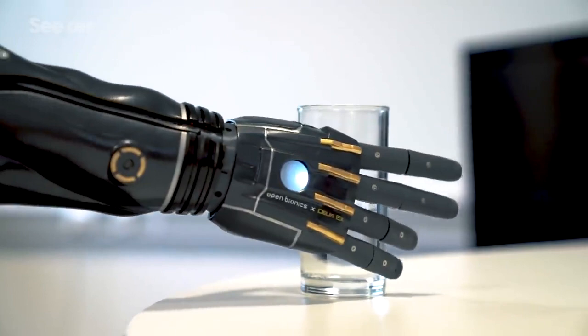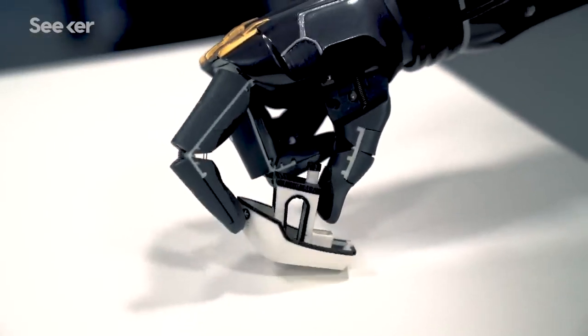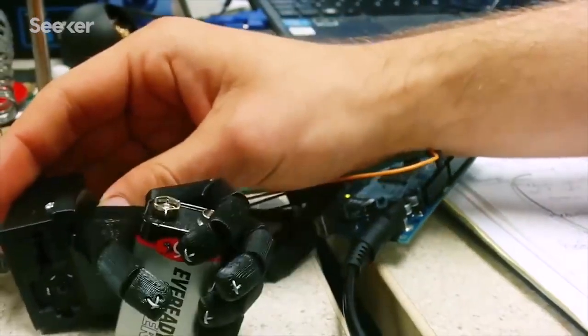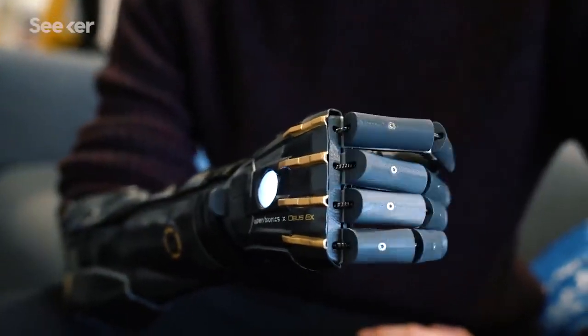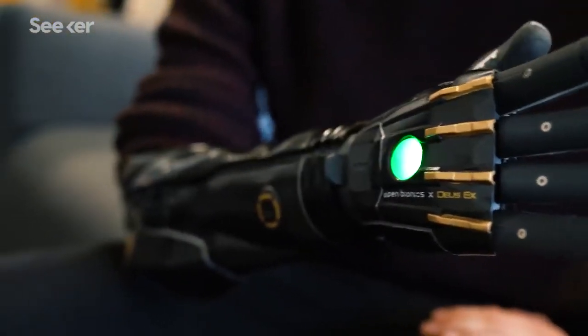We've got a multi-grip hand with four motors inside controlling individual fingers and moving the thumb. The Hero Arm works by picking up signals from a user's muscles — it has sensors on the inside of the socket that sit on top of the muscles and detect a small voltage when the muscles are flexed, and the hand moves in response.